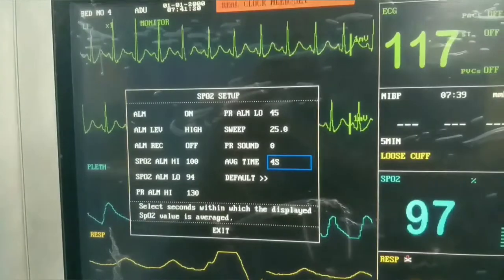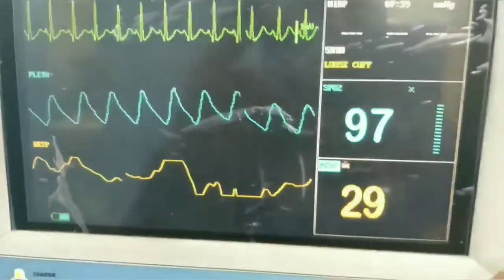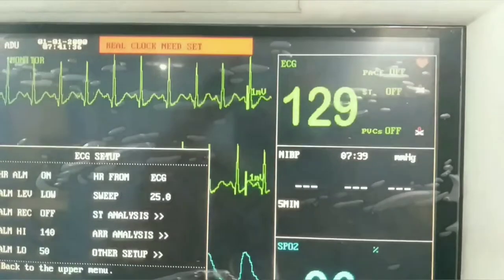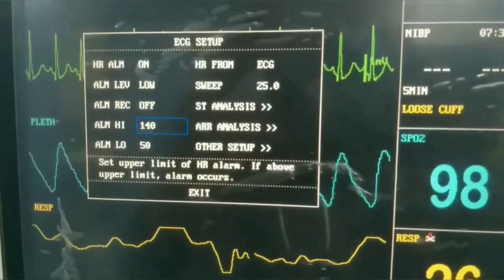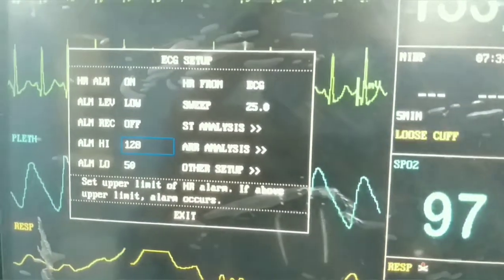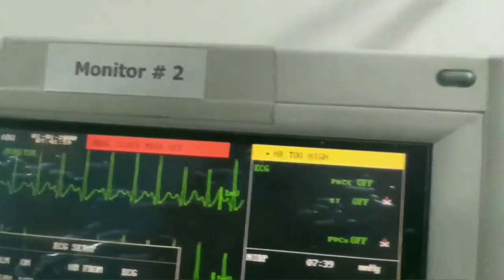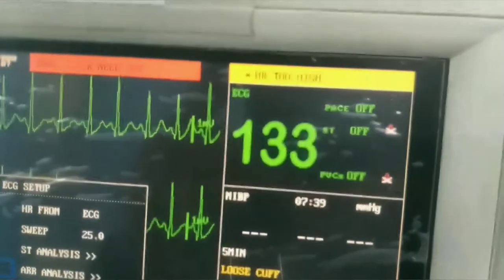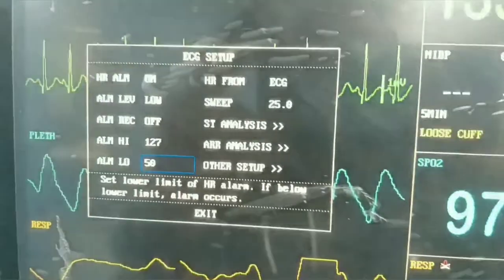We exit the SpO2 menu and go to the ECG heart rate setting. Pressing the ECG setting opens its menu — again there is an alarm which can be on or off. There can be a priority adjustment — low or high. For example, we have adjusted the higher pulse rate alarm at 127, and since the heart rate is 133, it is currently beeping. Likewise, we can adjust the lower alarm limit; if heart rate goes below 50 there will be an alarm.